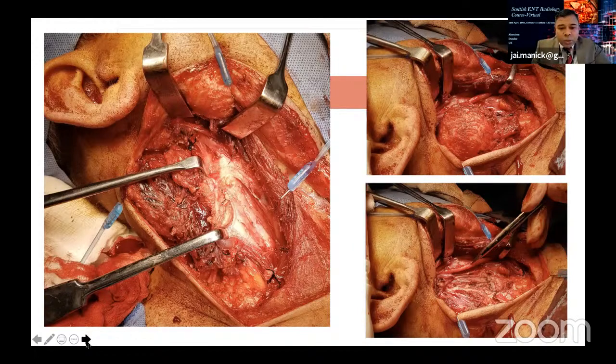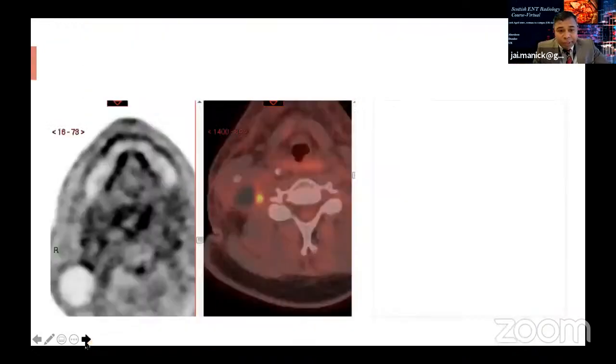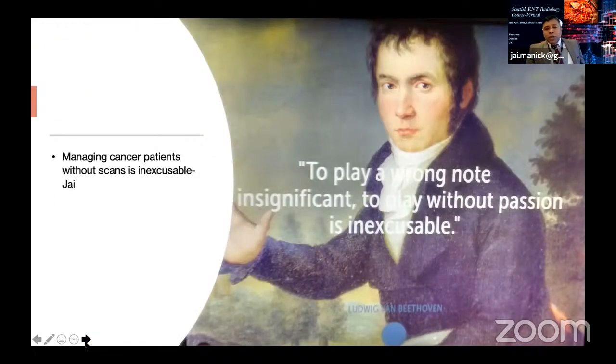The next thing was the tumor was sitting on the paravertebral muscles. I had to resect it, and the sternocleidomastoid was stuck in that area, so I had to resect part of the sternocleidomastoid. Essentially, this patient had a radical neck dissection, and the carotid was preserved. In this case, I even kept the vascular surgeon on backup.